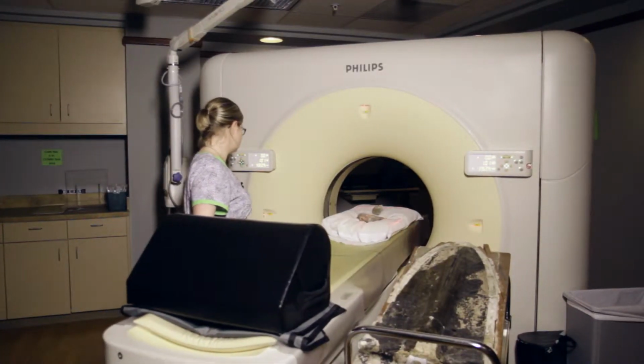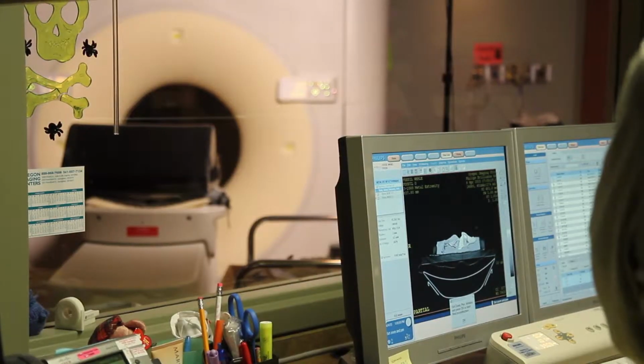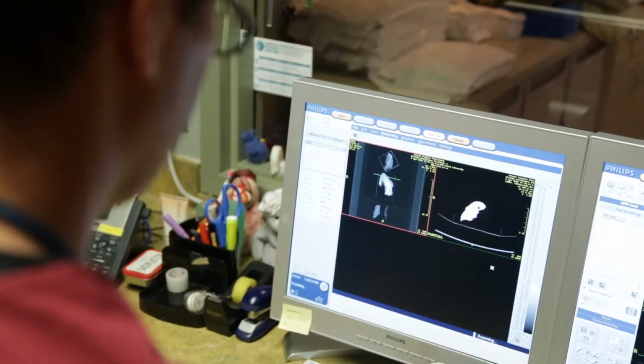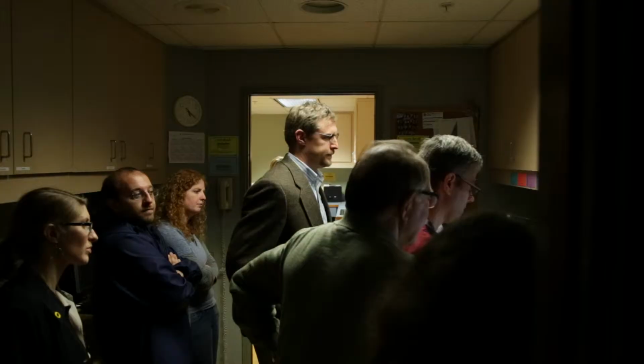We can see where all the nerves would have gone with the bones still in position without having to pull them apart. Other kinds of studies might actually still have to do destructive sampling, where we would look at isotopes in the bones. Karen Cleason, my colleague from the Philadelphia College of Osteopathic Medicine, is actually an expert in analyzing CT scans of fossil fish.